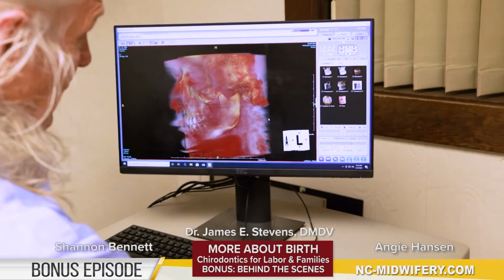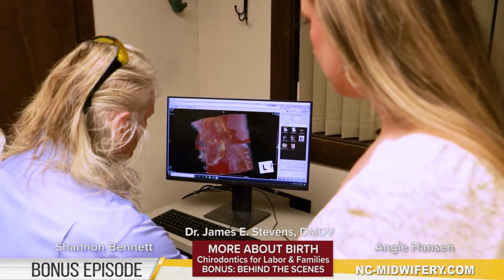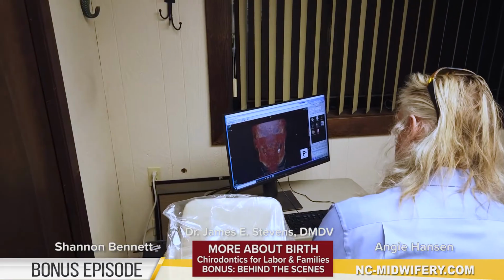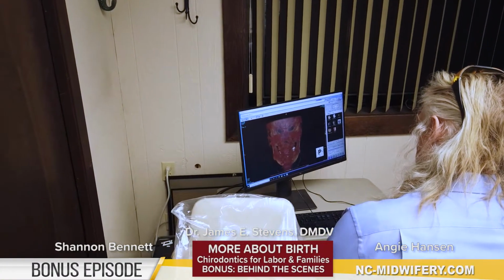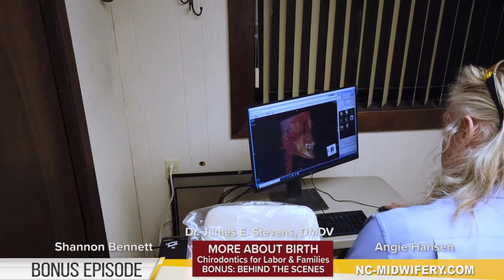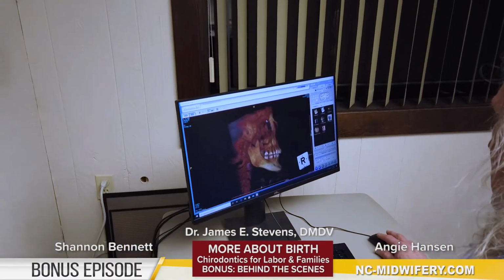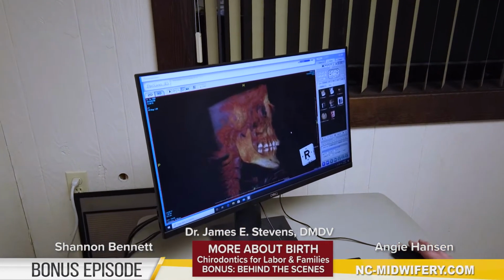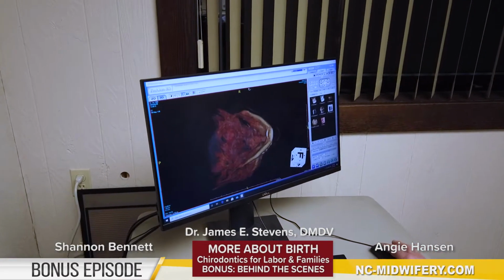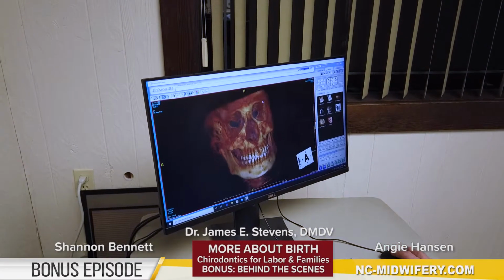We look at the spine. A lot of people have neck issues that they didn't know about. They thought their neck was just fine, but we'll look at that neck, and we can see if the spine is straight or not. I'd say 50% of the time it's not, and about 25% of the time there's a severe derangement there. Part of the issue the patients have, and that's when we'll start to use the chiropractic. We can turn this any way that we want, and it's incredibly helpful. We see a lot of different issues when we do that.